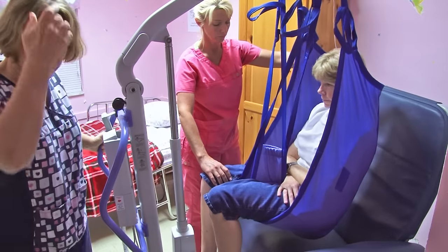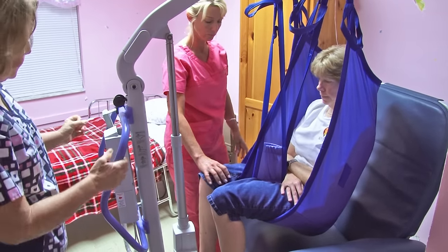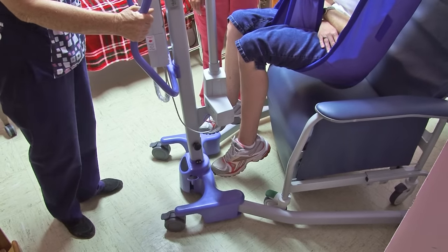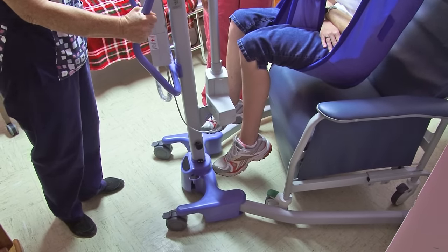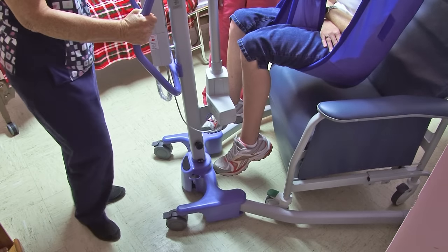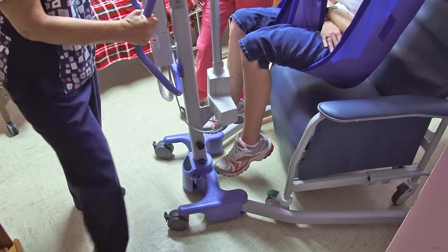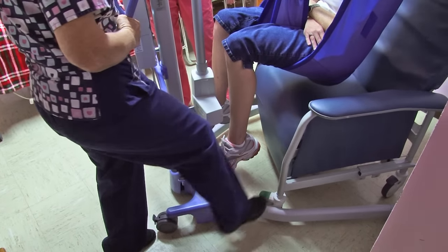Double check that the locks on the Jerry chair are on. Now that we're in position, we're going to relock the wheels on the Hoyer Lift and recheck the wheels on the Jerry chair. Your team member can help you with that.